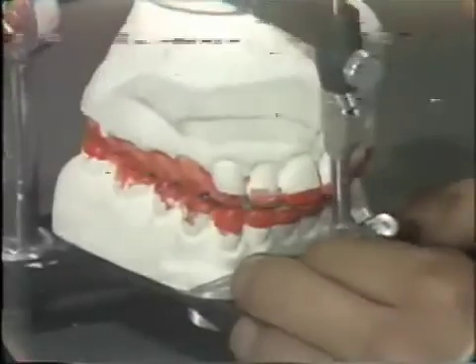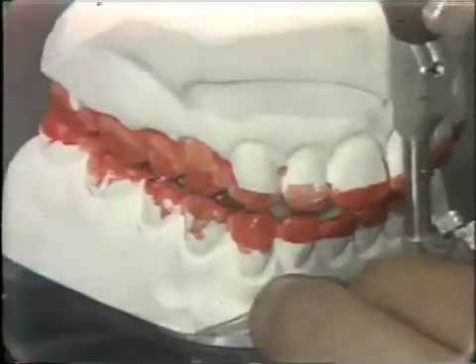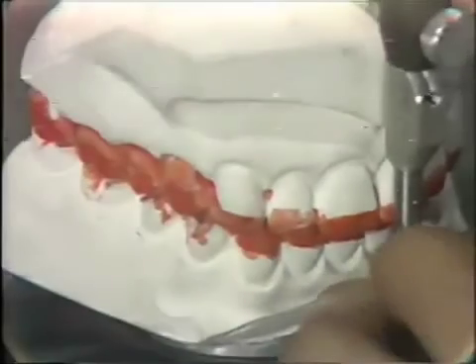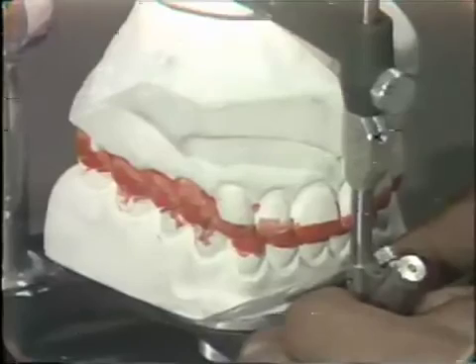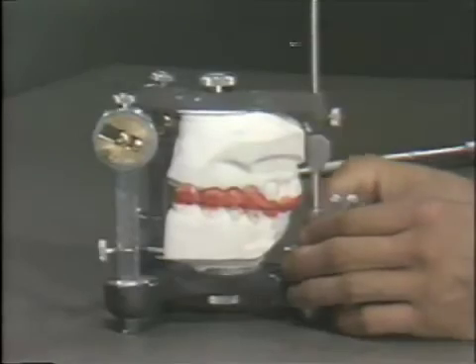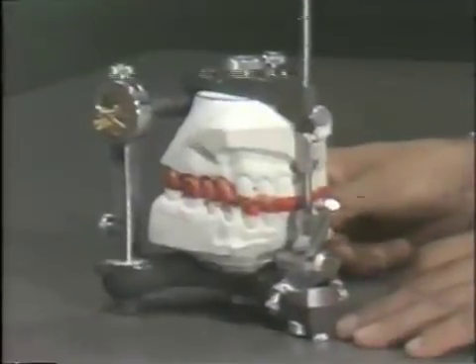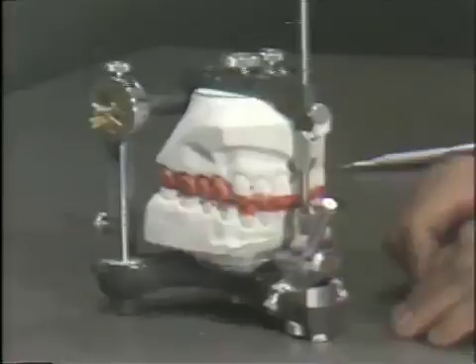On this side we go into excursions and we still have a smooth — if anything, slightly smoother here — and this would be because the cuspid is brought into a more intimate contact with the upper cuspid against the lower. So upon checking this in centric relation, we find that no further adjustment is necessary on this particular mounting. Your mounting may be slightly different and may require an additional adjustment. What one can check for the clearance on balancing is to use the shim stock or to use wax — one should not have a maceration or tearing of the wax, but just have a slight perforation in the centric position. This will complete the adjustment of the cast in both centric relation and in the lateral excursions; we will then have to check the protrusive and do any adjustment in protrusive that we find necessary.